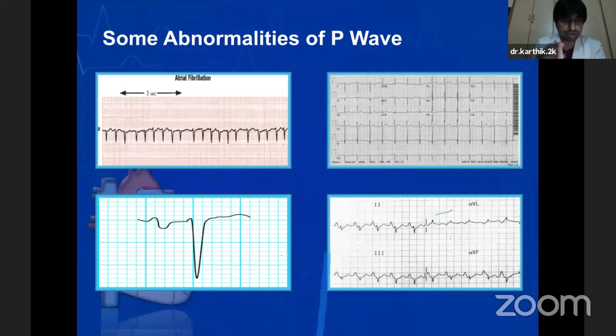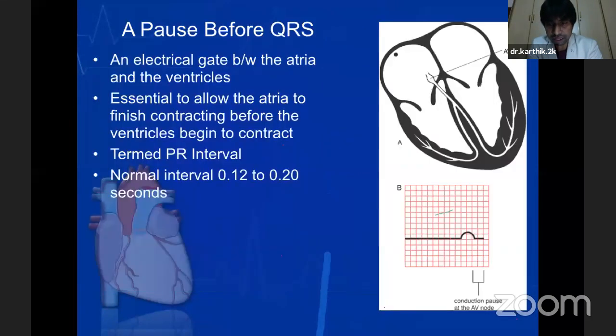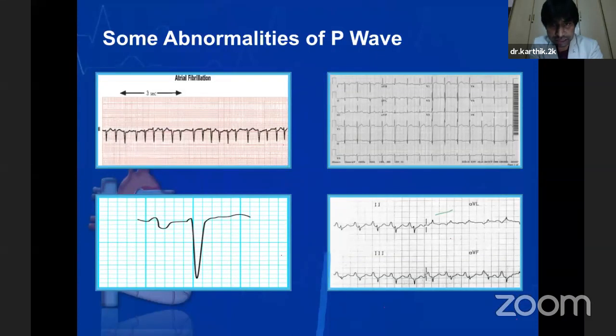You can see that the P wave is both up and down, inverted. So that is a biphasic P wave. It is present both above and below the horizontal axis. And in the last illustration, you can see that the P waves are much taller than the preceding T waves. So that indicates that there is a chamber enlargement.